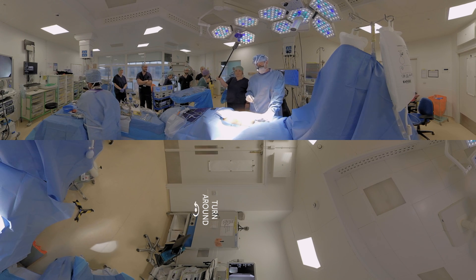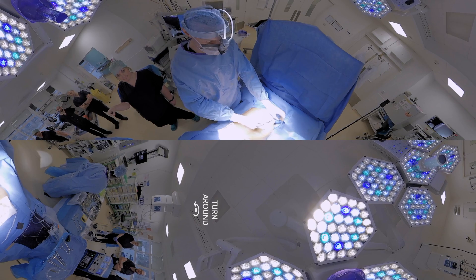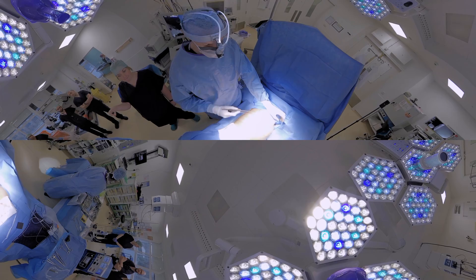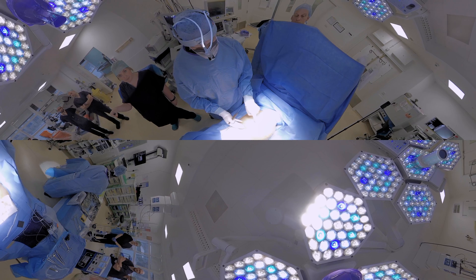We've turned Janet onto her side and we're going to operate through the right side of the chest. I've drawn on the scapula, or shoulder blade, and I'm going to make an incision underneath the shoulder blade, across the back, open the ribs, and get into the chest.